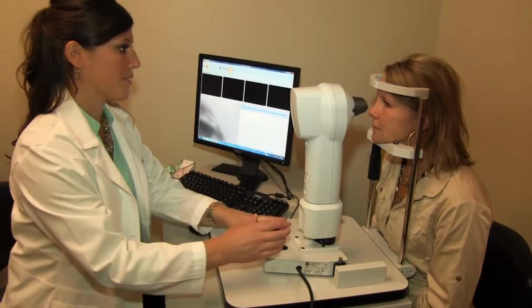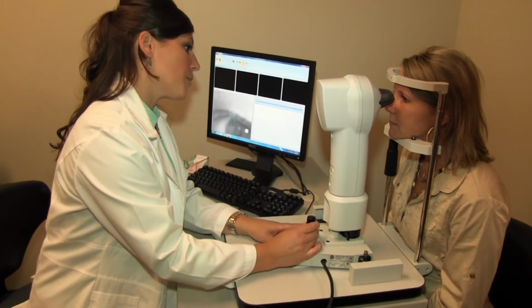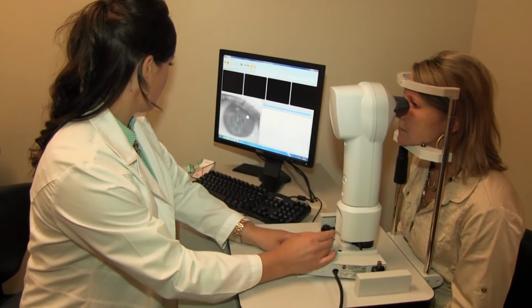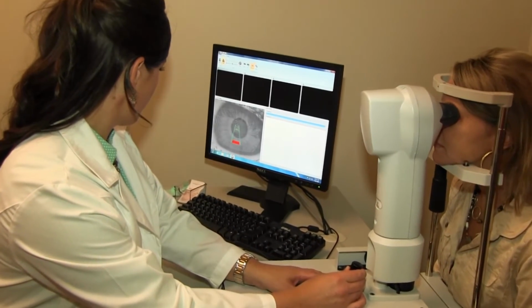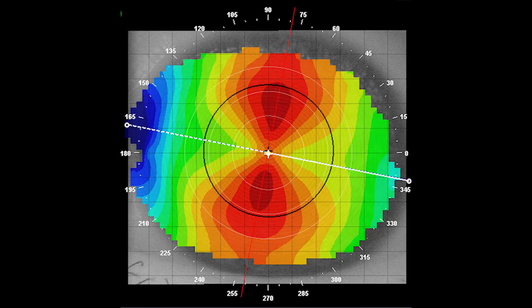While it is not necessary to have a corneal topographer, it is certainly helpful in designing the patient's lens. Not only does it give another measurement of pupil size and horizontal visible iris diameter, it also helps in the lens back surface design. If a patient has a moderate amount of astigmatism that extends limbus to limbus, I may order a toric lens design to assist in lens stability.